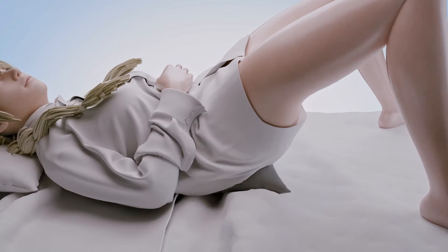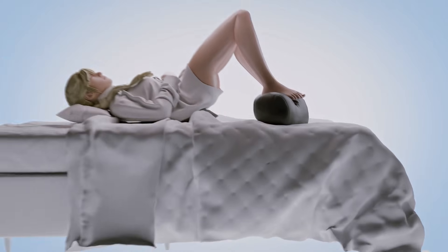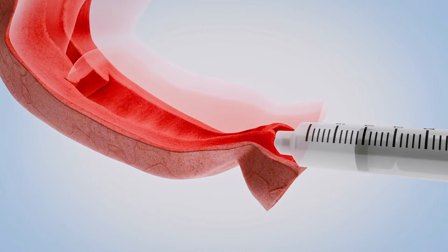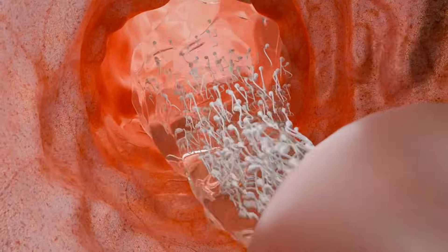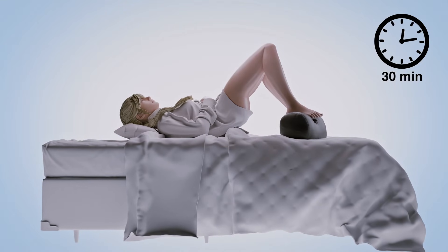Lay down on your back with your pelvis slightly elevated — use pillows to help with this. Gently insert the syringe into the vagina as close to the cervix as possible. Carefully deposit the sperm by slowly pushing the plunger until the syringe is empty. Once the syringe has been emptied, remove the syringe and remain laying down for 30 minutes.